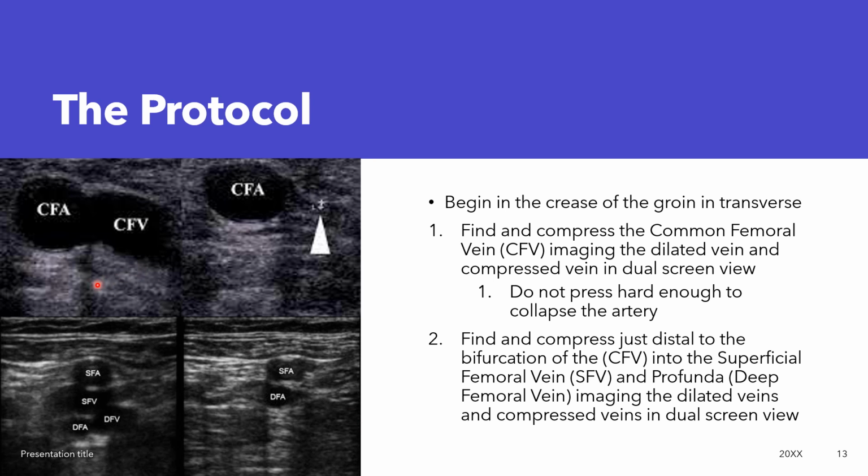Okay, so right here in transverse, we evaluated our common femoral vein. We evaluated it without and with compression. We moved slightly down, and we evaluated our superficial femoral vein and our deep femoral vein just prior to their confluence without compression and then with compression.